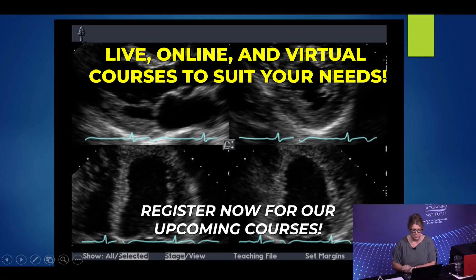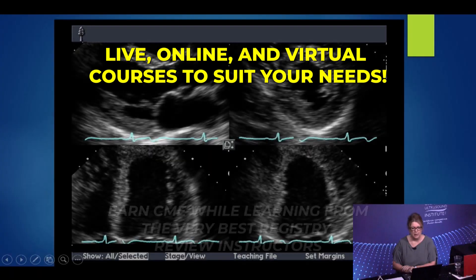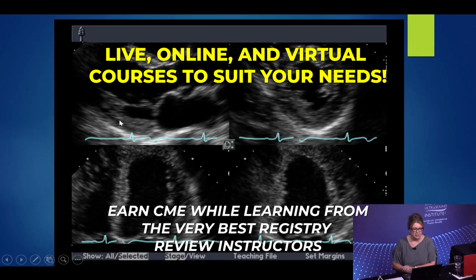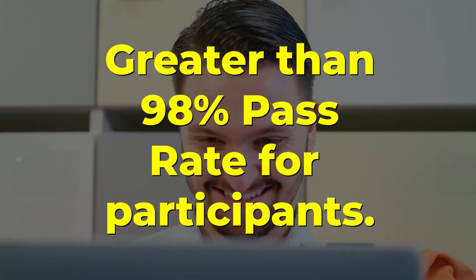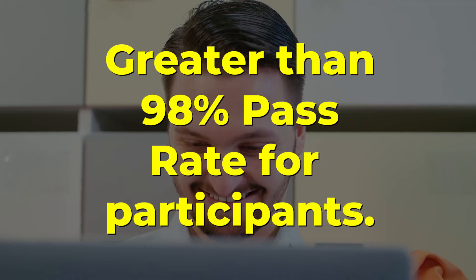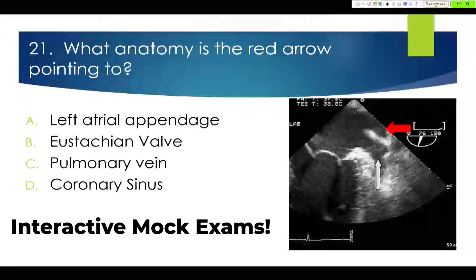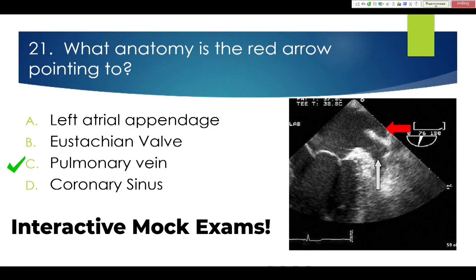Here are your images. Know the four images that we take for stress echo, and make sure you know your wall segments. They may tell you to click on your inferior wall and ask what anatomy a red arrow is pointing to. The white arrow is your left atrial appendage, and right above that is your pulmonary vein.